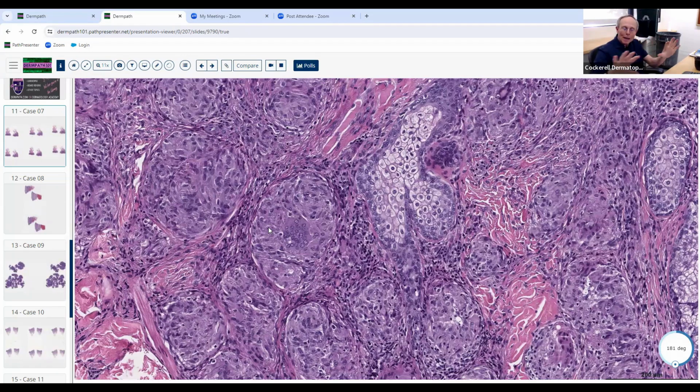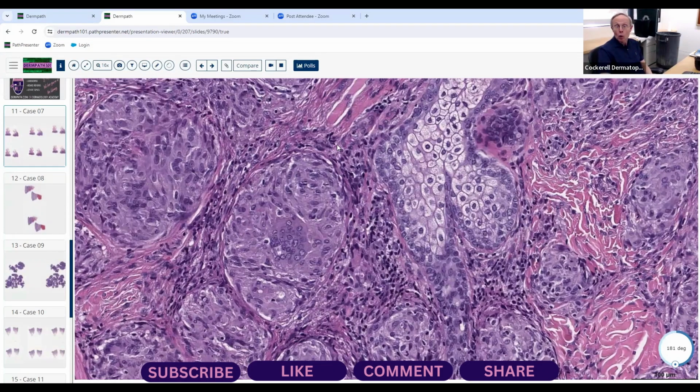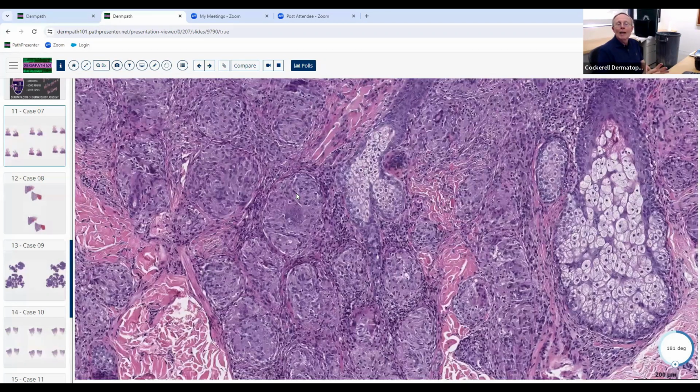It's kind of a diffuse pattern, the lepromatous pattern, where you get all the foamy histiocytes that are filled with the organisms. When you get a very brisk inflammatory response in tuberculoid Hansen's disease, it develops a sarcoidal granulomatous histology, but it's called tuberculoid Hansen's disease because years ago it looked more like tuberculosis when they had scattered lesions as opposed to diffuse lepromatous Hansen's disease. It really looked like tuberculosis.